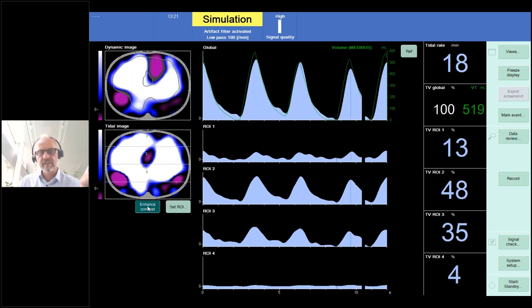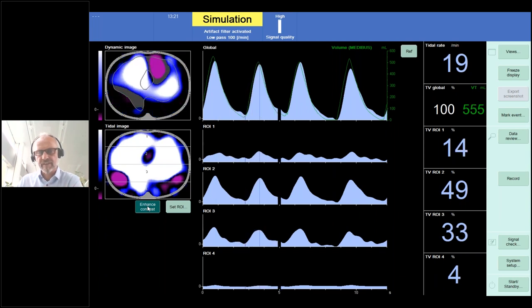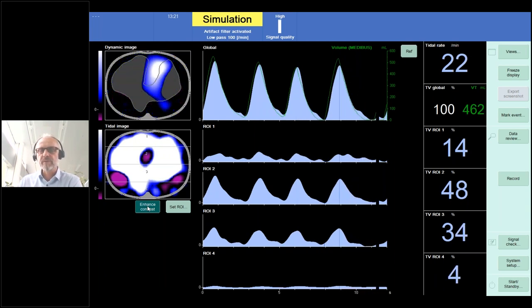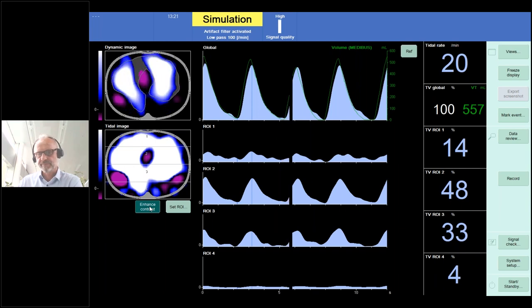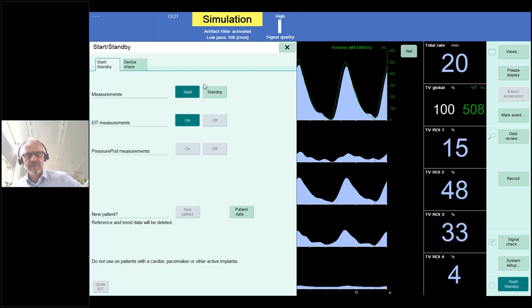So there's no ventilation because there is pleural effusion present at this part, and we have a study demonstrating this. And then, of course, if there's pleural effusion, a recruitment maneuver should only be considered after draining this fluid. Okay, so another example of a non-recruiter, and that was done just with this tiny little test.